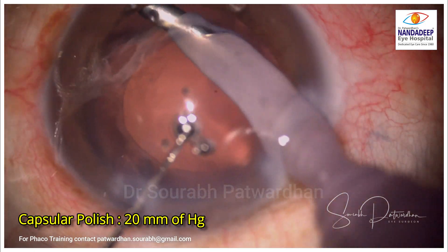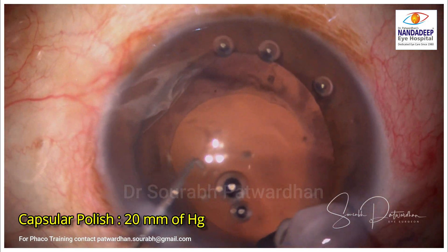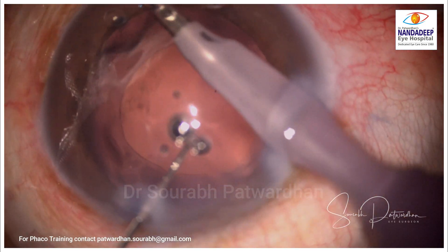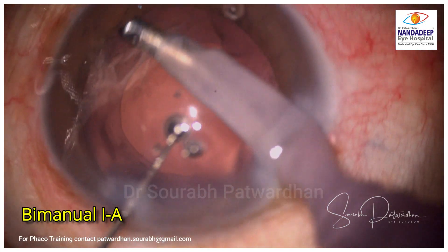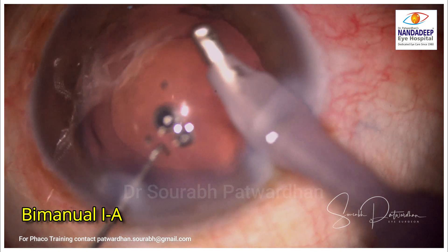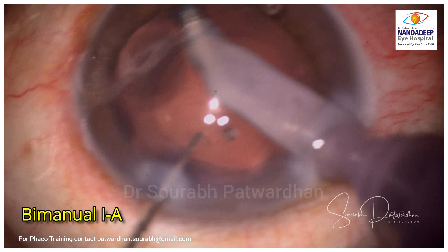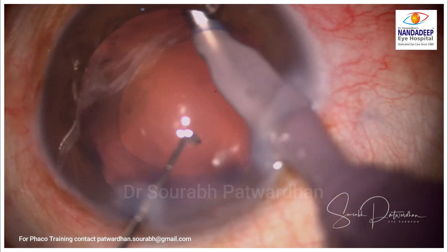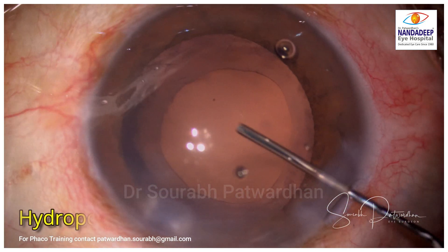When you do the polishing of either the posterior capsule or some part of the equator, use a vacuum of around 20 mmHg, which is very safe for the posterior capsule. Try to go to all quadrants and remove the posterior capsular fibers — you can see a few cells and opacities there — and polish them off as far as possible.